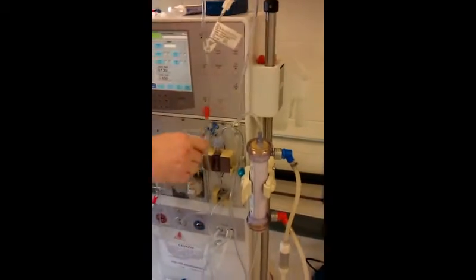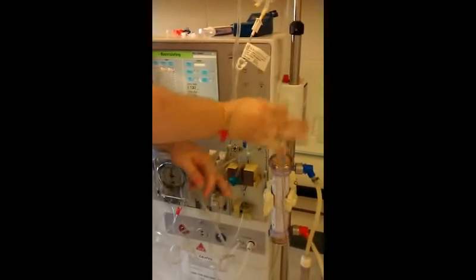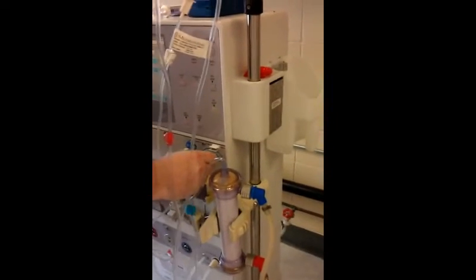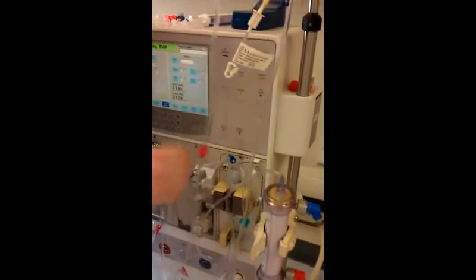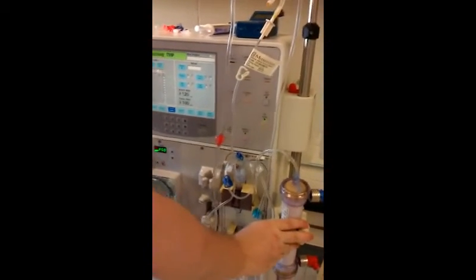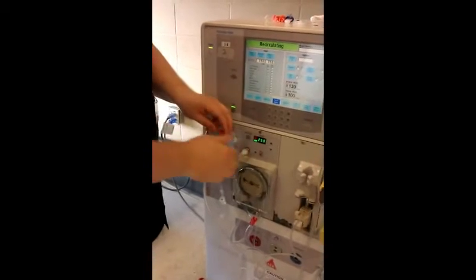Now you've got to connect your transducer lines — they're the ones that have a little white transducer protectors on there. Sometimes you have to keep hitting reset. I connected that line and unclamped it. And the same thing with this one — I'm going to connect this line and unclamp it.